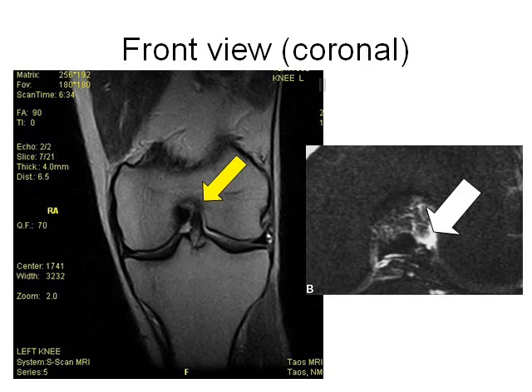The front or coronal view is also helpful for visualizing the ACL. The yellow arrow shows the normal ACL attachment on the lateral wall of the femur or thigh bone notch at the 2 o'clock position. On the right, the white arrow shows bright white fluid because the ACL is torn off the lateral wall of the intercondylar notch.